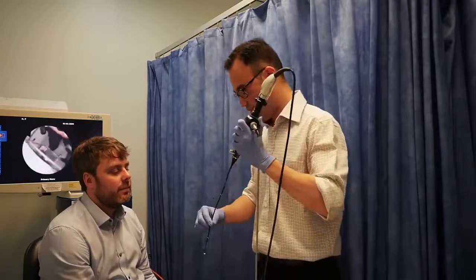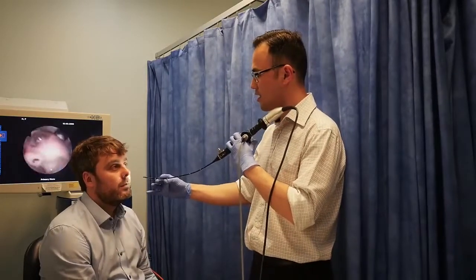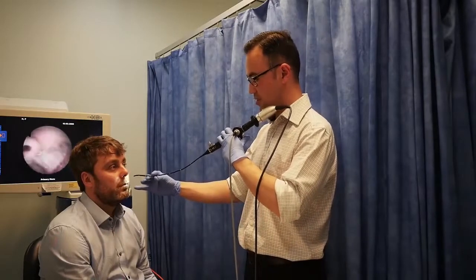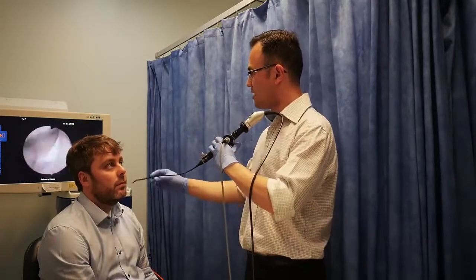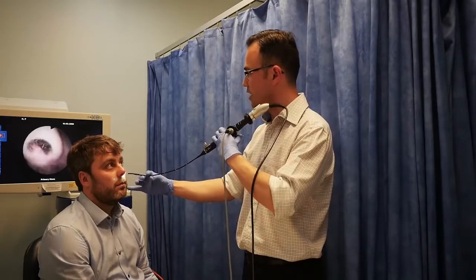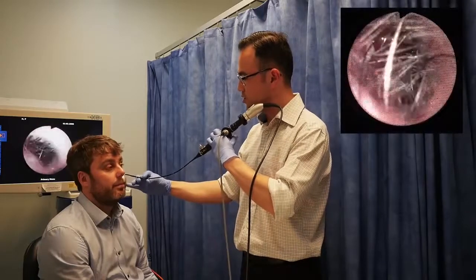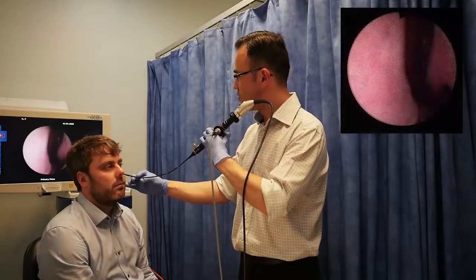Okay. So the first thing you need to do is make sure that you're orientated well. And I like to just keep the scope nice and straight at this instant. There you go. And as you can see on the screen, that would be the view that I would normally get if I was looking to the eyepiece. I'm going to use your left nostril first, okay? I'm just going to touch your nostril now, and I'm just going to start passing it into the nose.